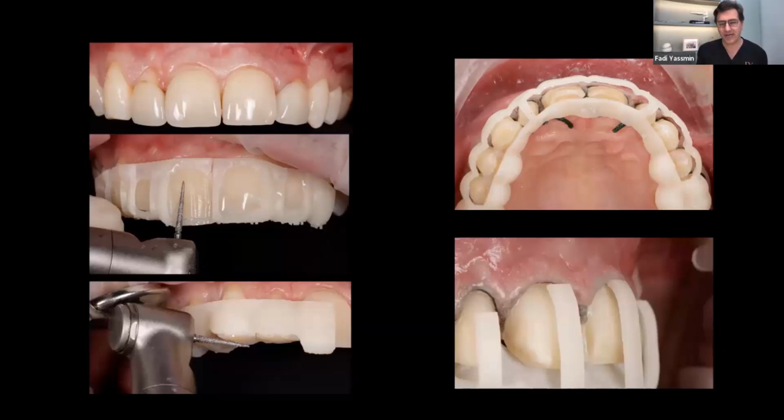Yeah, no, it's definitely the case. And the more you practice dentistry, and I've noticed this even with implants, you've been doing it for years and you think your implant placement is just going to get better and better. But until you start doing guided stuff, you realize, excuse my French, how crappy your placement was prior to using guided dentistry. I used to pride myself, I'll open an implant. Now, guided. That's it. It's a no-brainer. You've got everything, just do it.